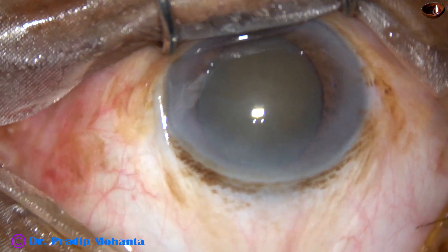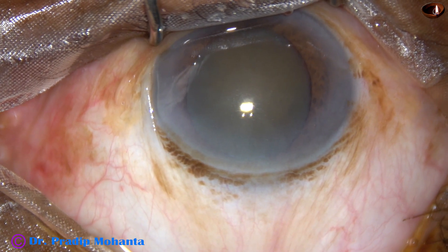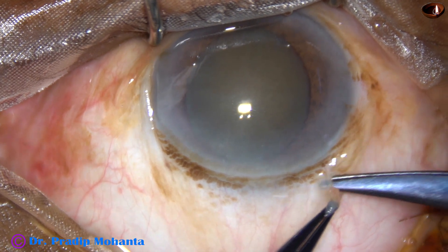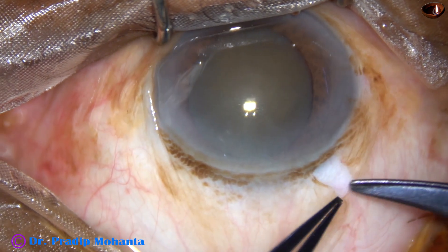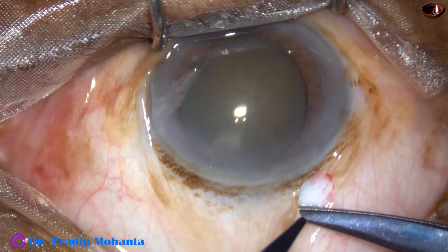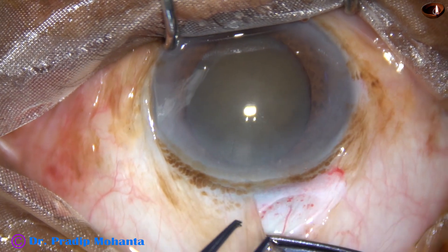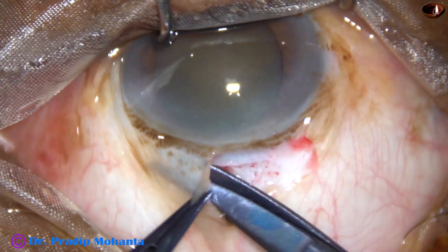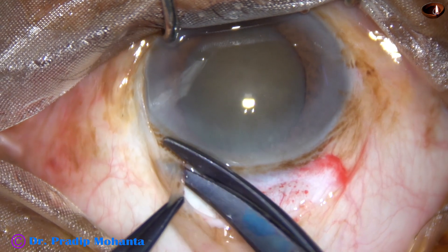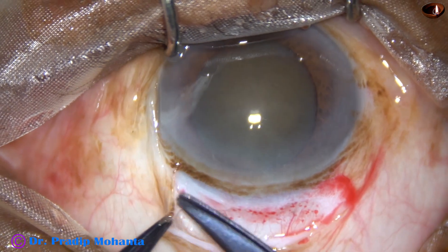Now we have to do conjunctival peritomy. The incision is going to be about 8 mm, because the cataract is quite hard. There is a thick Tenon's — making an opening in the Tenon's and doing the peritomy along the posterior part of the limbus. Peritomy is done.